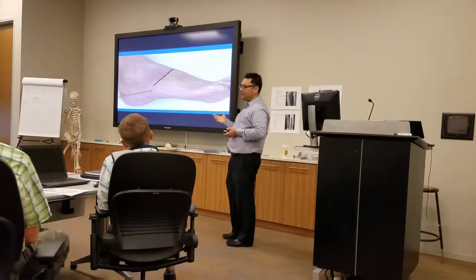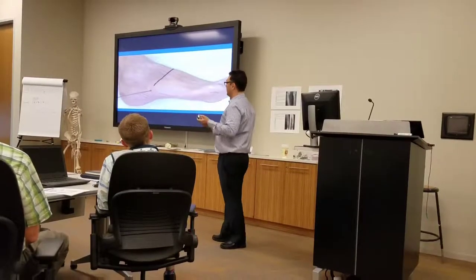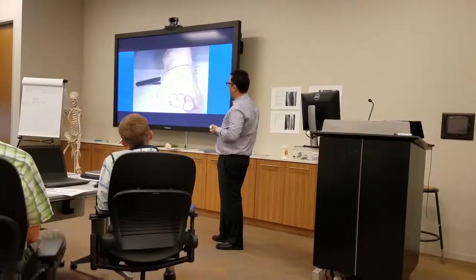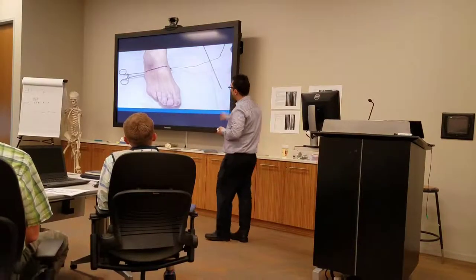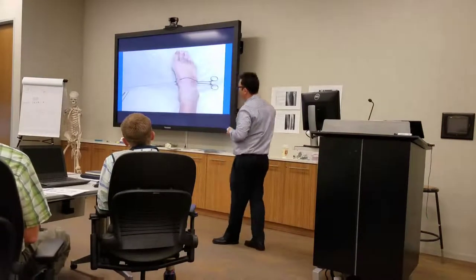You've got to use X-ray. If somebody's going to pass the Gigli saw without using an X-ray, I pity them. So here's what it looks like with a brown handle, just passing it through plantar. You see how you're pulling that through from side to side. Here is your suture, connected to the Gigli saw. You pull medial over to lateral.